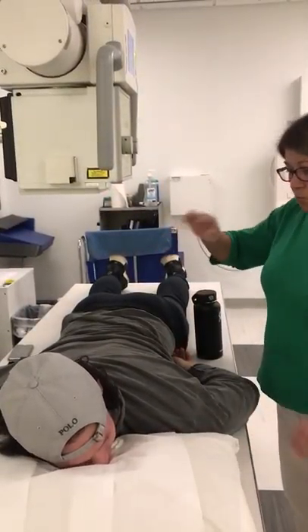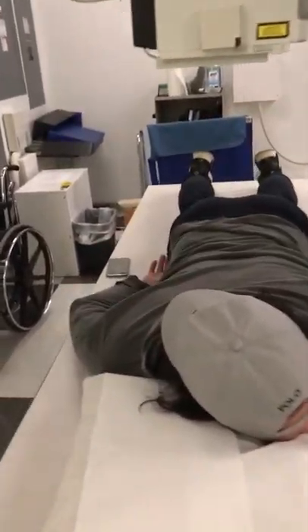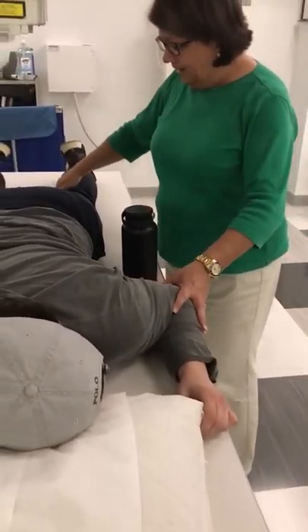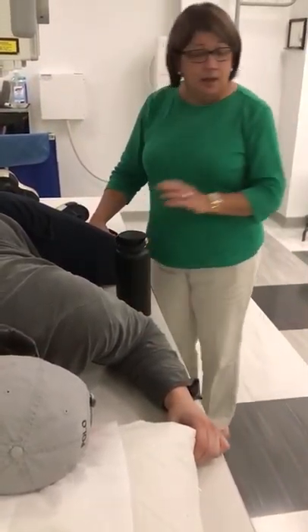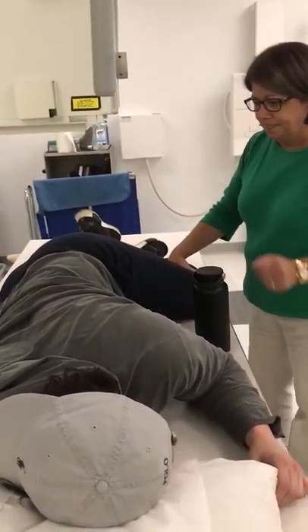Okay, so in the RAO position, the right arm is always going to be down alongside of the patient. I want you to flex this left arm. And I want you to flex this left knee, bring this knee up. Okay. I want my patient to be rotated 35 to 40 degrees.